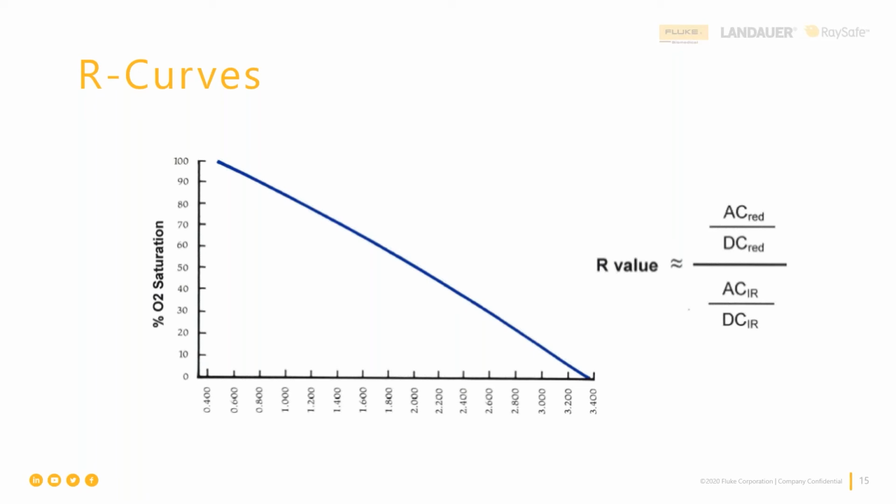And the clinical study part of it is a breathe down study where we draw blood gases while a patient is being deprived of oxygen that they're breathing purposely. And these are all volunteers. So this is on the manufacturer of the pulse oximeter to do these breathe down studies, and that is the basis and foundation for their design validation and for their ability to get approval to market that pulse oximeter in most countries in the world.